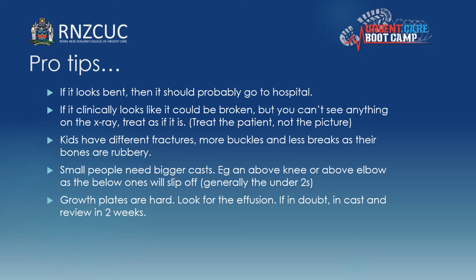And pro tips for urgent care: if it looks bent, send it to hospital. If it clinically looks like it could be broken, but the X-ray is normal to your eyes, treat it as though it's broken. Time and cast will be good, and then the people in clinic can sort that out.